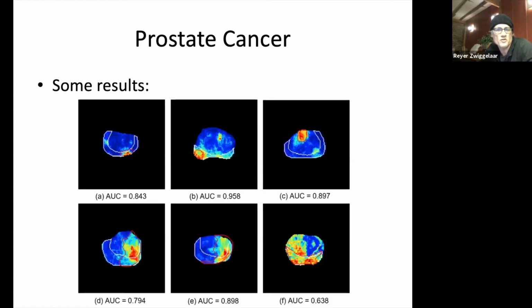And as you can see, again, a similar approach where a red line indicates the abnormal region indicated by the radiologist, and what we've detected is shown with a color map, a heat map. We do pretty well, and we get a good area under the ROC curve here. These are very good results and state of the art.